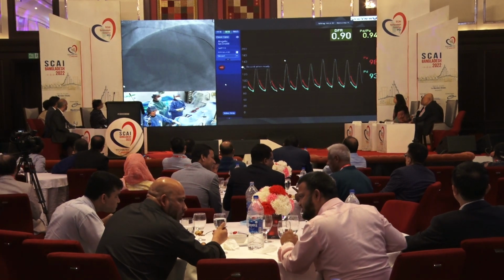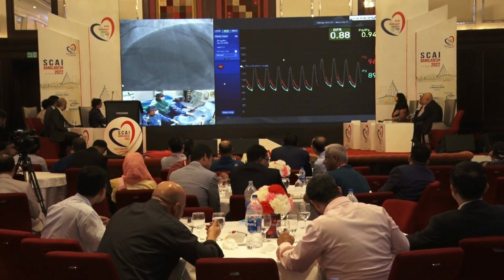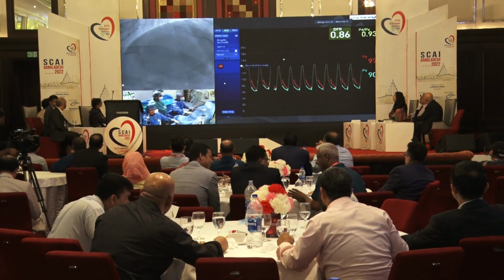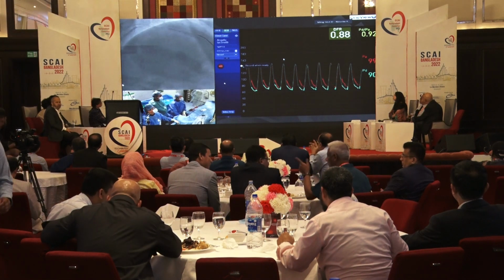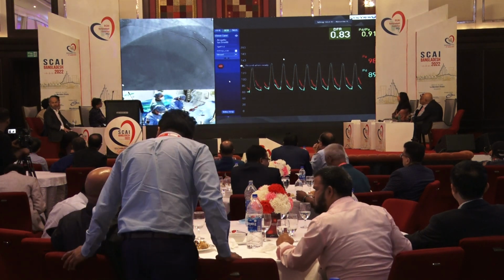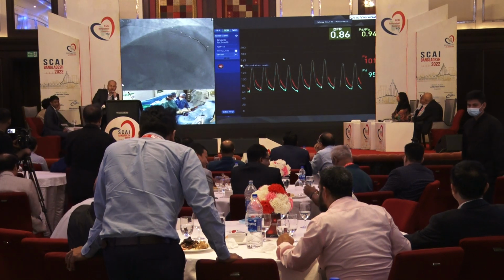Sure, for sure. So let me leave this pressure wire distally, like this, and let me do an inflation with the drug balloon. I use the other wire that I have there. So we already have opened a 2.5 balloon, which is excellent.